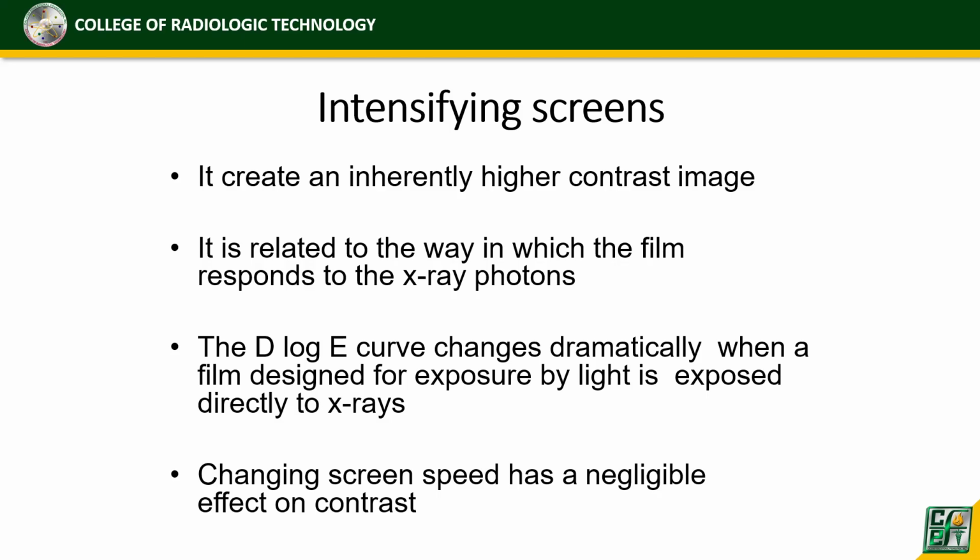Okay? So, when using the correct film screen combination, okay, it will have higher contrast image. Okay? So, it is related to the way in which the film responds to the X-ray photons.